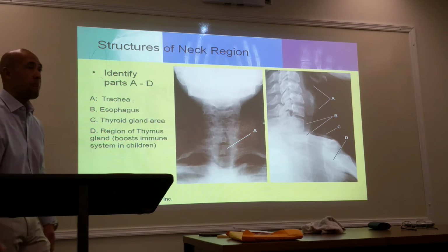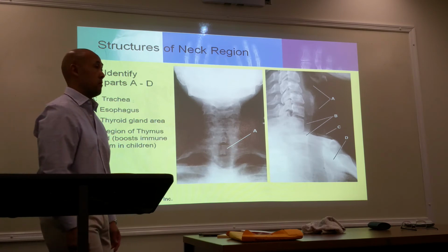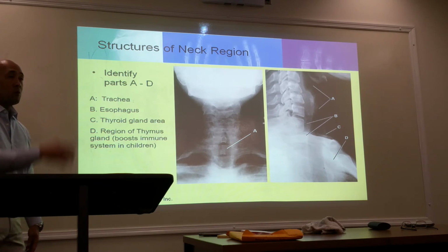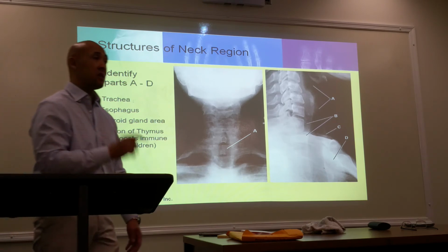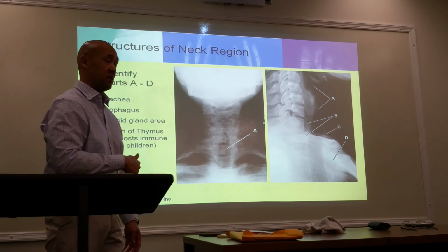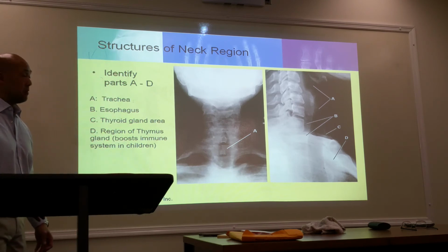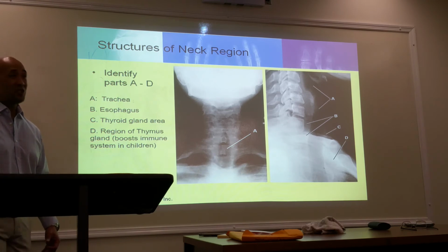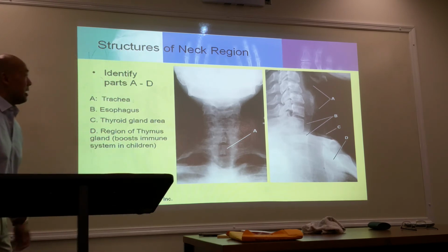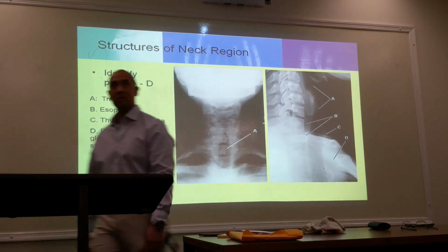Are they going to give them something to drink and then get the X-ray done for seeing the soft tissue? Not necessarily. When we're doing a neck study, it would be a study of the esophagus if they're drinking the contrast. Then we're evaluating the esophagus, not the trachea. Are they suspending respirations when you take them? They are suspending respiration, but there's still air trapped in there. You can't completely expel it. It stays in the tract. Okay, any questions here? And what's that structure up here, right above A? Hyoid bone, okay, hyoid.